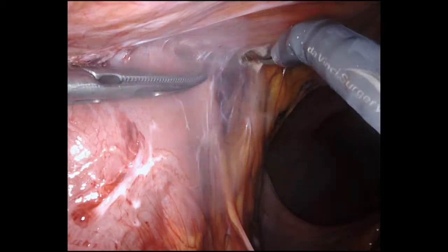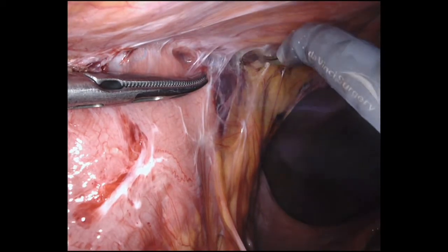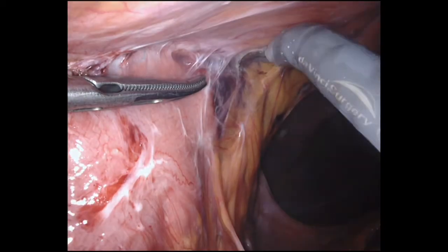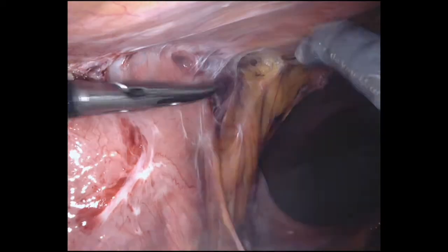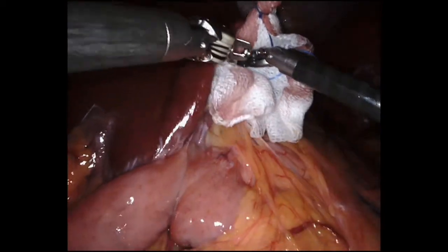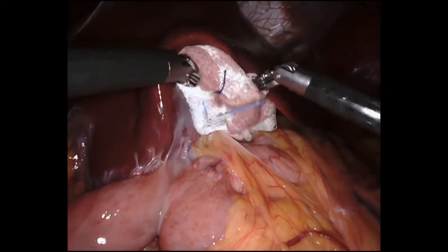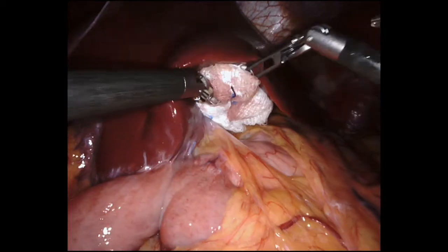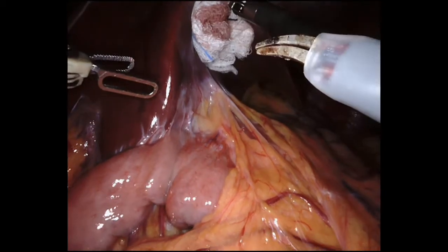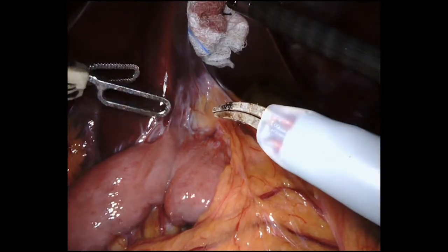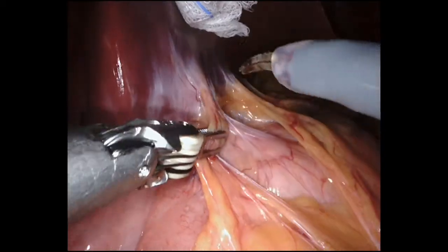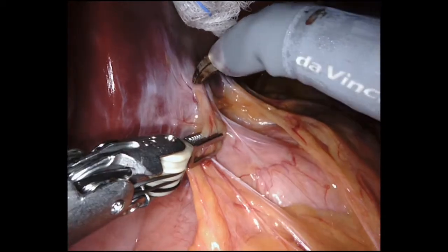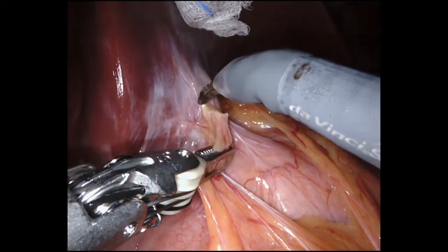Operation begins with division of adhesions from the previous operation. The liver is retracted and the pancreatic jejunostomy is identified. The anastomosis is carefully dissected from the liver surface with robotic scissors.